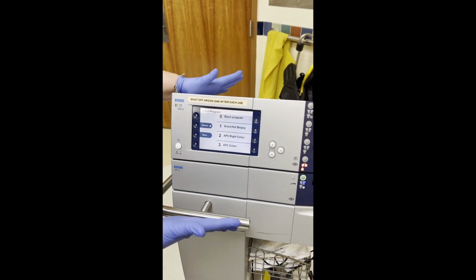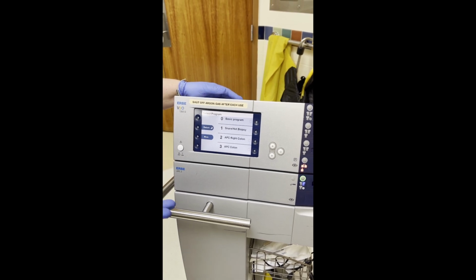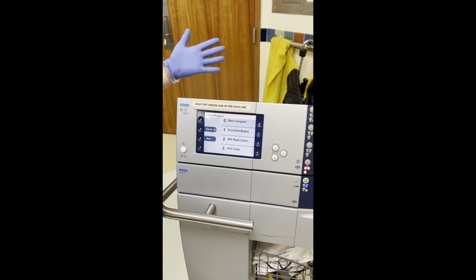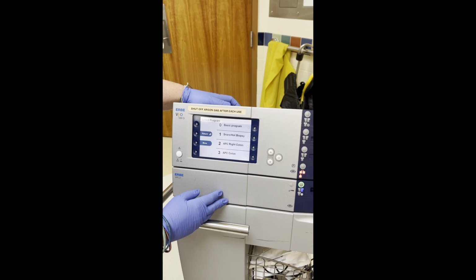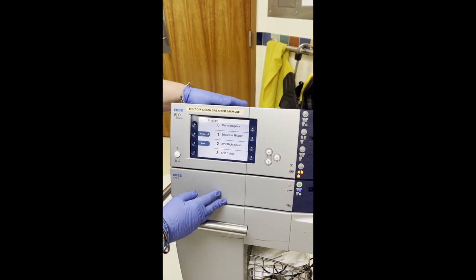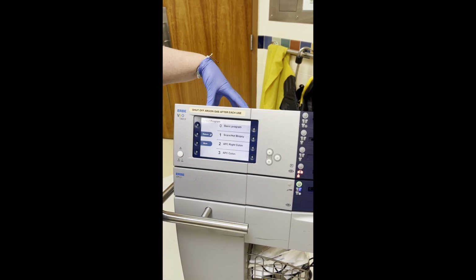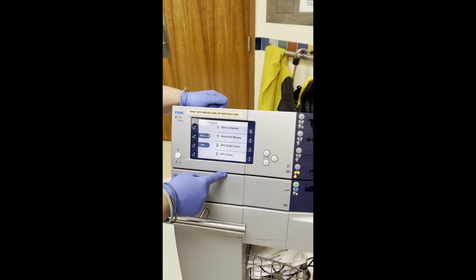For instance, a lot of times we do urgent or emergent ulcer bleeds, because you can bleed a lot out of an ulcer. So if you're going to do APC, and I'll explain what APC is in a minute, to turn on the ERBE, if you're in the stomach, just think you need to be in the stomach list.